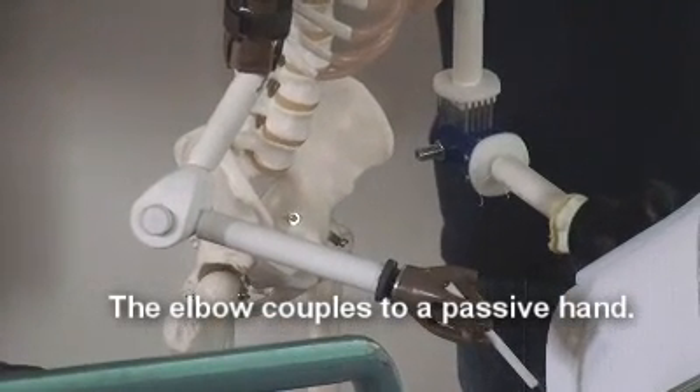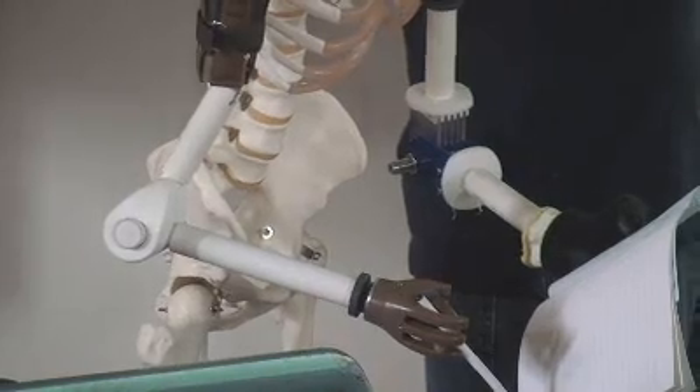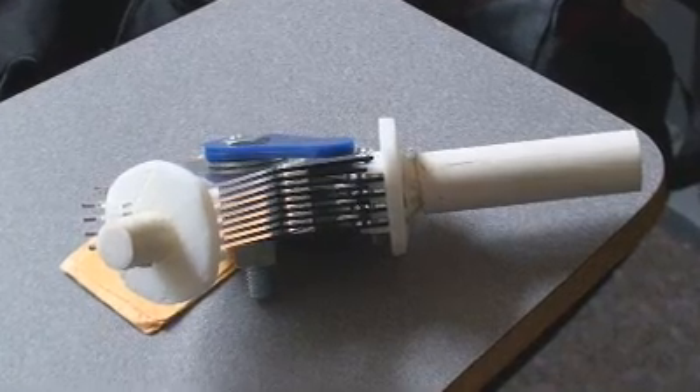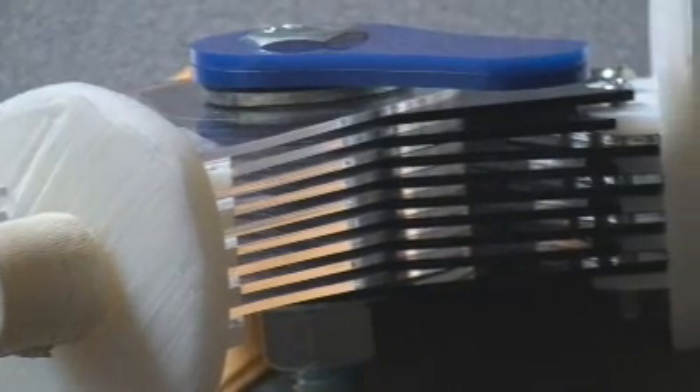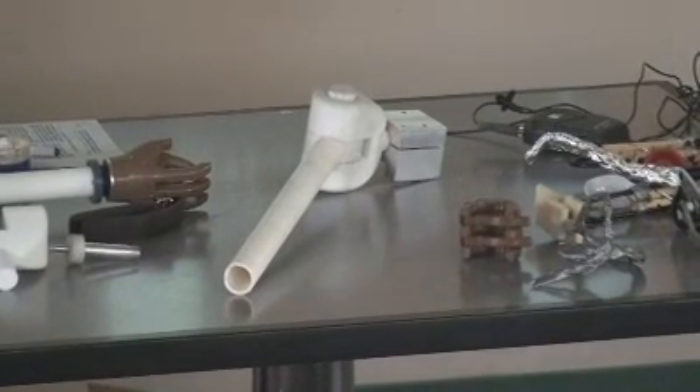We sort of had two design paths for the elbow, both of which we thought were really robust. One is very easy to clean and very quick assembly. The other has a few more moving parts, but would be very robust and last that amount of time. One is friction locking, as it clamps down a series of teeth. And another is a button that slides back and forth, that we're really excited about.